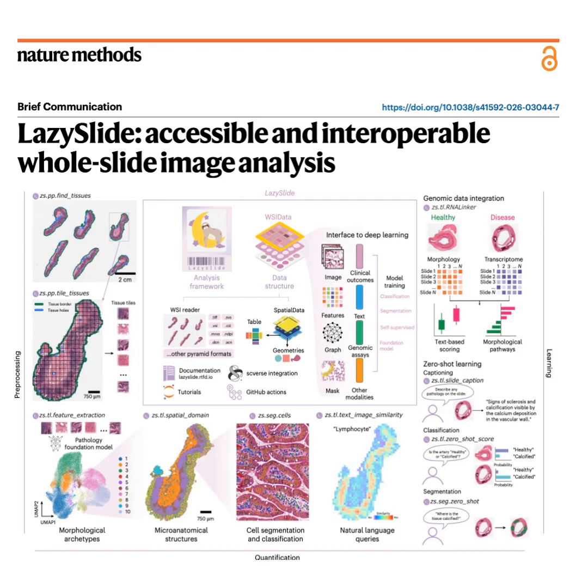Okay, time for another quick recap. So LazySlide segments the tissue using Otsu's method, or AI, then chops it up into pristine tiles. Right. Then vision models turn those tiles into mathematical vectors, and that brilliant STR tree algorithm elegantly solves the border cell problem by merging the polygons. You've got it perfectly. So here's a question for you listening. If you had to teach an AI to recognize a biological neighborhood, like a specific part of your lung, what visual clues would you tell it to look for first? It's crazy to think the AI is figuring this out just from math.